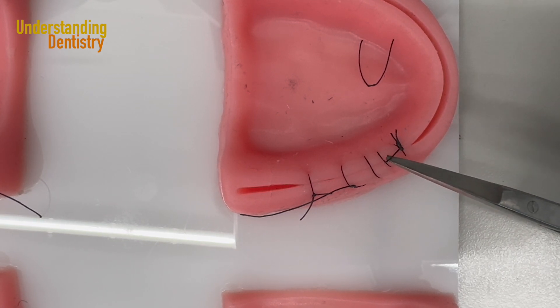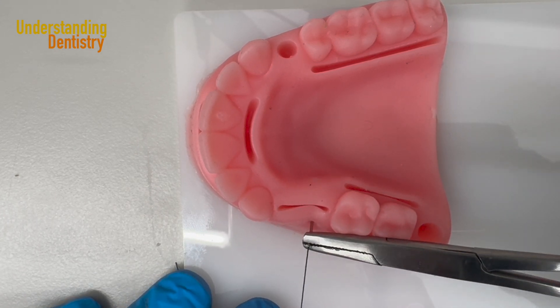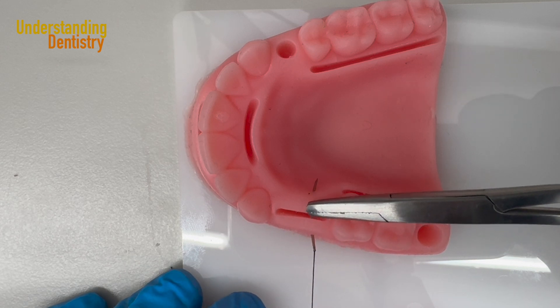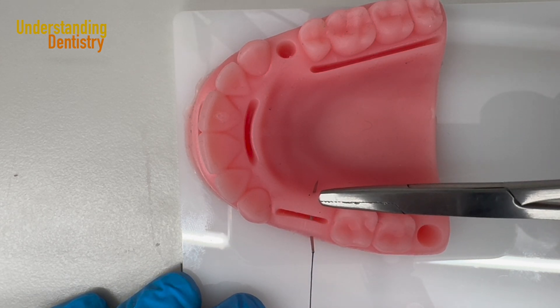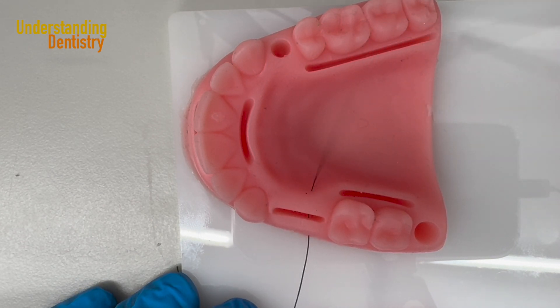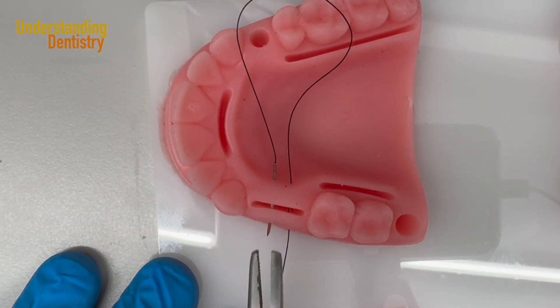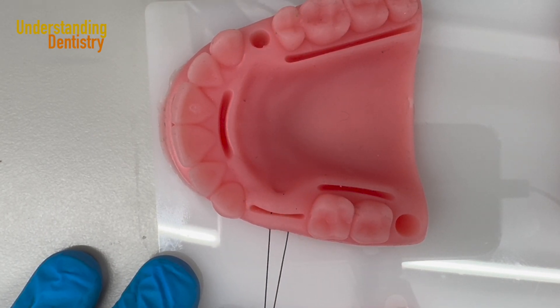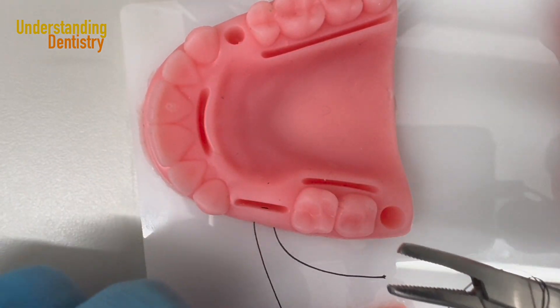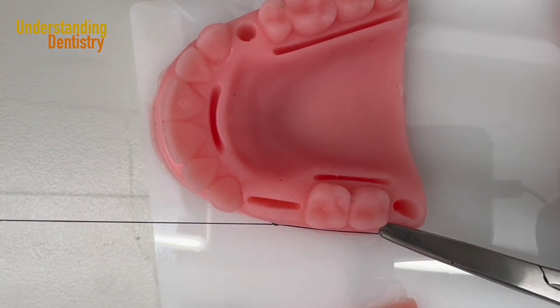For the horizontal mattress suture, I start buccal — going buccal to lingual. If the borders are far away from each other, capture first the buccal; your needle will come out in the middle of the socket. Then capture only the lingual — you don't need to capture buccal and lingual tissues at the same time. Now I come back from lingual to buccal. Then I finish the knot: one, two — counterclockwise — and capture the tip. Only one hand pulls. That completes the horizontal mattress.